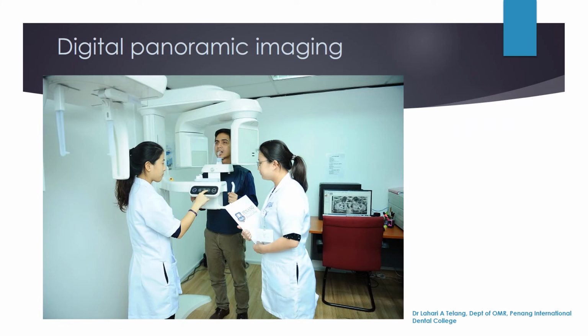Now, digital imaging is not only for intraoral imaging. Even the panoramic, cephalometric, and CBCT are all types of digital imaging. In fact, for extraoral, moving on to digital imaging has happened faster than it has with film-based intraoral periapical imaging. And this is just a picture from our clinic, which shows you the imaging done for the panoramic radiograph or patient positioning.